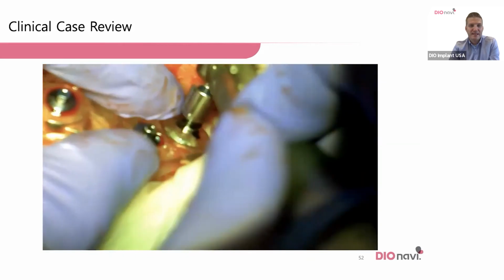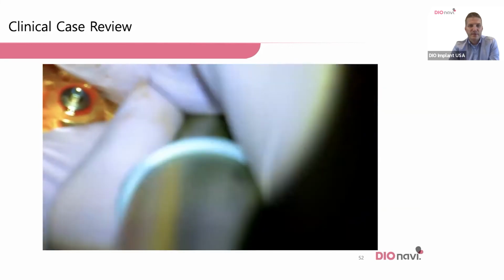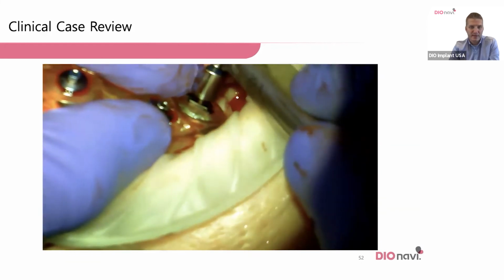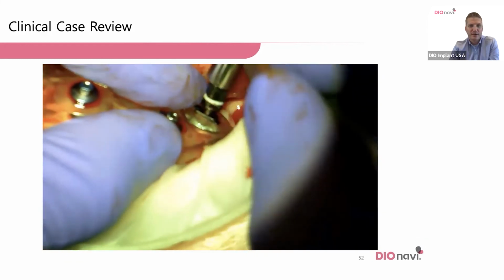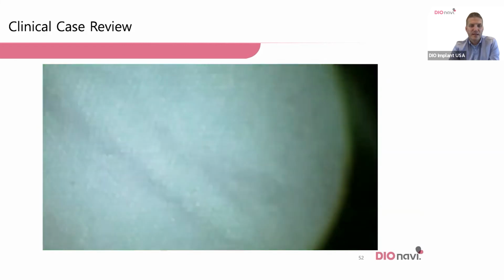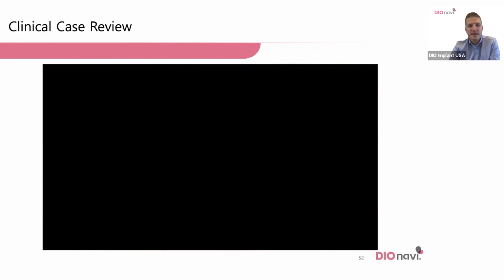I'm now maxed out at torque, and I'm just kind of hand cranking it. You always get a little excessive torque reading because of the friction between the guide and the driver. So I don't mind doing a little hand pumping there to get it down a little further. I'm going to take one more view at it. There it is in place, and that's the surgery.